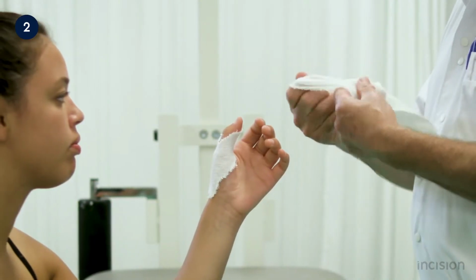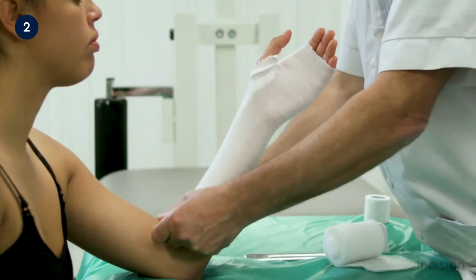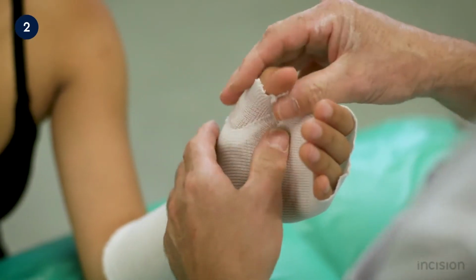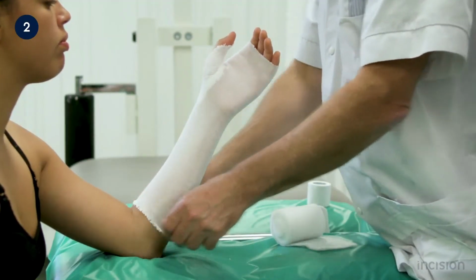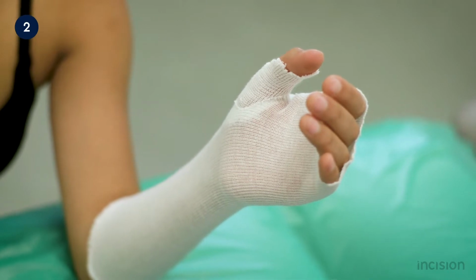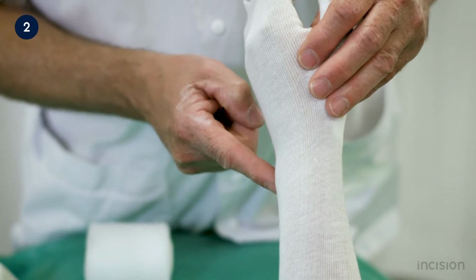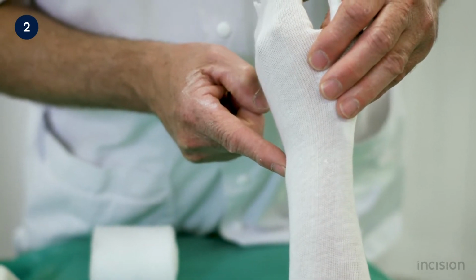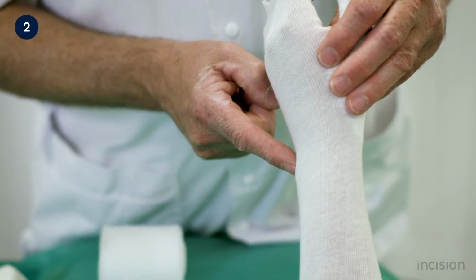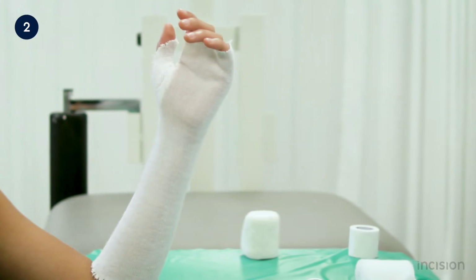The stockinette is then rolled up and gently passed over the entire hand and entire forearm of the patient. Note that the stockinette is wrinkle-free, as wrinkling may cause irritation of the skin. Next, the padding needs to be applied. Care should be taken to apply extra padding over the ulnar prominence to avoid pressure complications. Too much padding should be avoided, as this may cause the splint to be too loose and be able to move over the arm, which may lead to scratches or blisters.